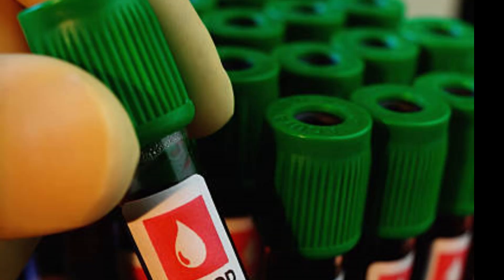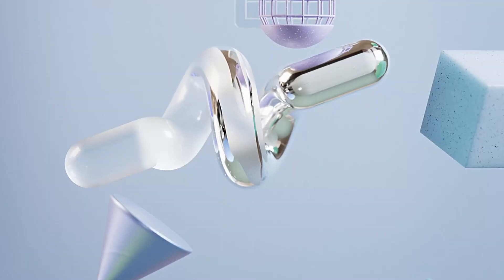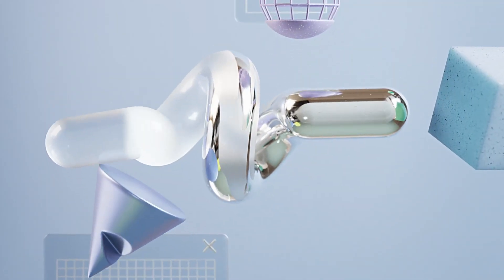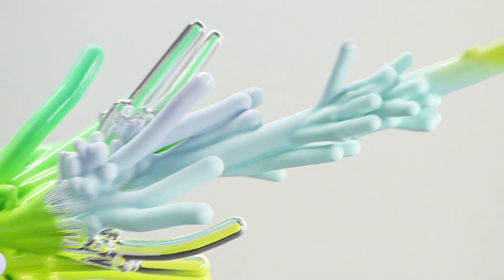Moving on to the green tube. This one contains heparin, which is another anticoagulant. It's perfect for plasma studies and electrolyte testing. Basically, if the doctor wants results quickly, green tubes are the go-to.